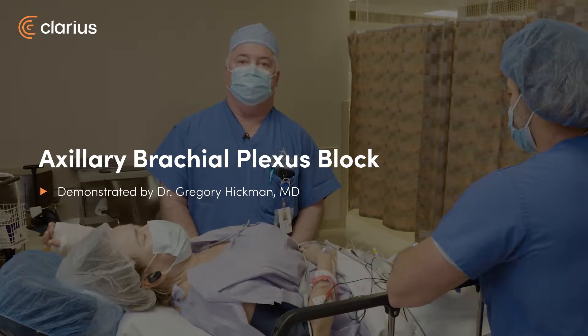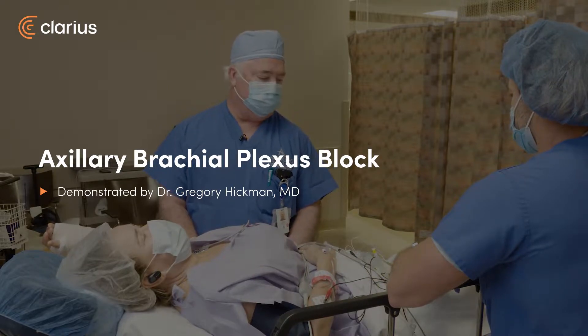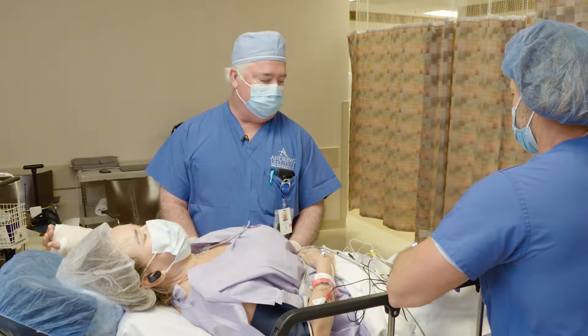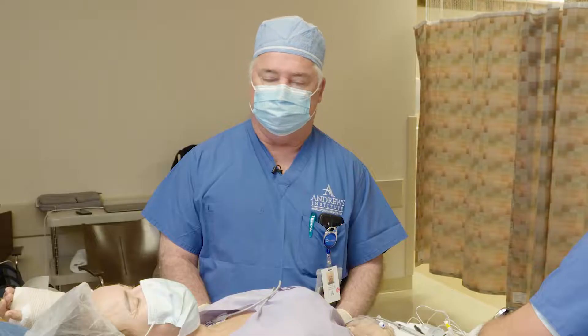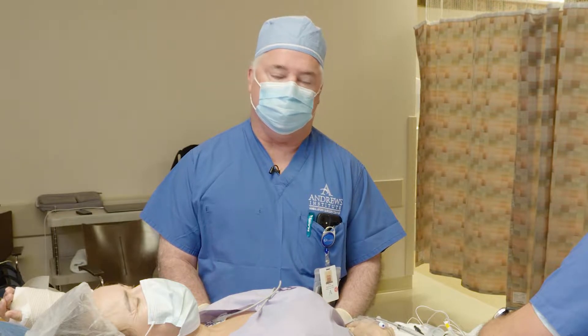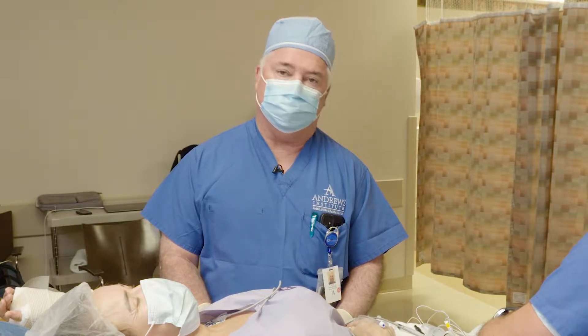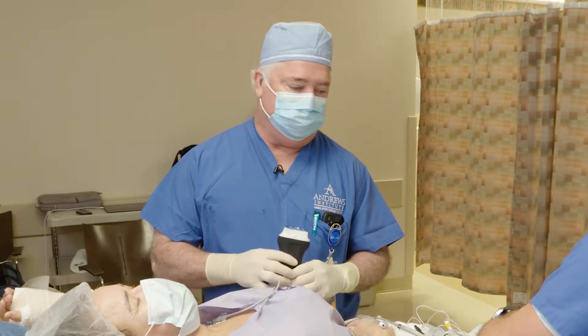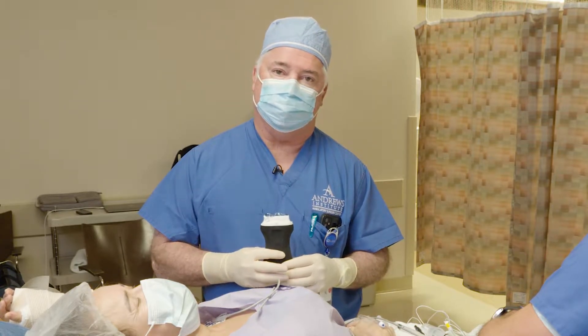Hi there, this is Dr. Greg Hickman from the Andrews Institute. We've got a young lady here with a radius fracture. We're going to get her fixed up today — we're just going to do an axillary block on her. These set up really fast, work really well, and they're really easy. It's very superficial and very easy to see with our Clarius ultrasound.